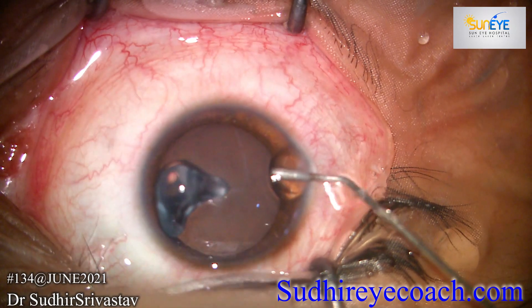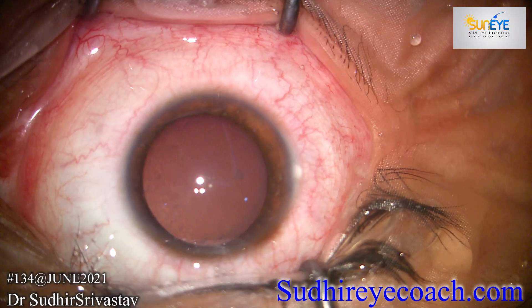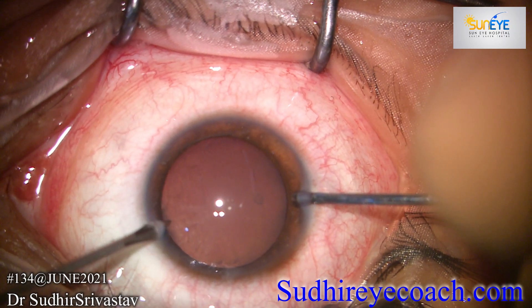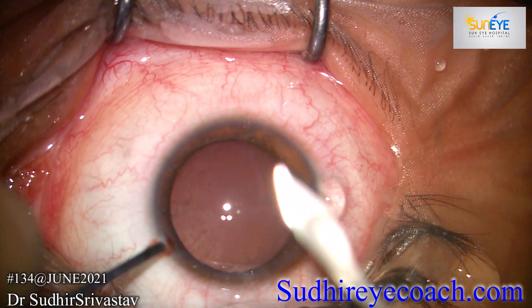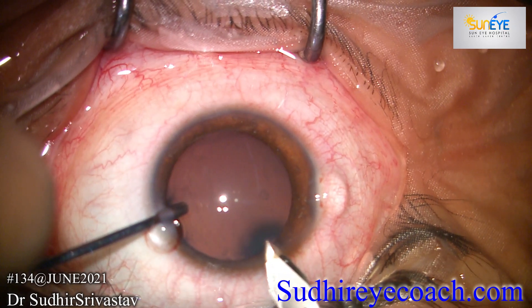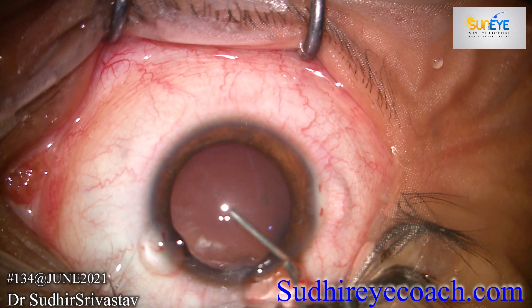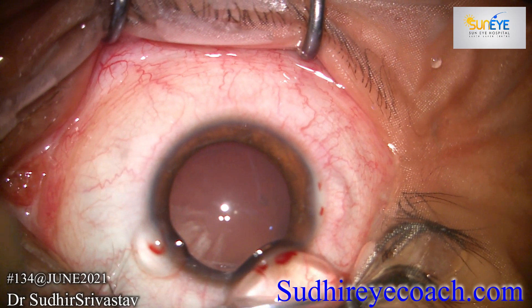Created first side port incision and through the side port filled the chamber with viscoelastics. Then made a second side port incision. A 2.8 mm clear corneal incision was made at the steep axis. The ICL was already loaded in its cartridge. The chamber was again tightly filled with viscoelastic.